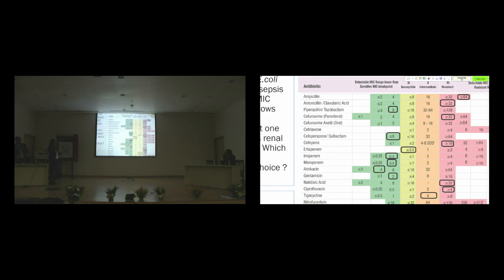Say suppose you have a pan-resistant isolate, resistant to all the drugs, but still the clinician will ask, tell me one drug which might act. So it is exactly opposite here. Nearer to the center, that is a better acting drug that can be chosen as a last resort. So for sensitive, it should be farther from the yellow zone towards the green zone, whereas for a resistant isolate, it has to be nearer to the yellow zone. Maybe our clinicians, Dr. Venkat and others, will find it useful when you interpret it. So this is how we use the MIC guiding table. You have to take the template, plot the clinical isolates, and see which one is a better drug that can be added in the comment along with the template. Understood, everyone?